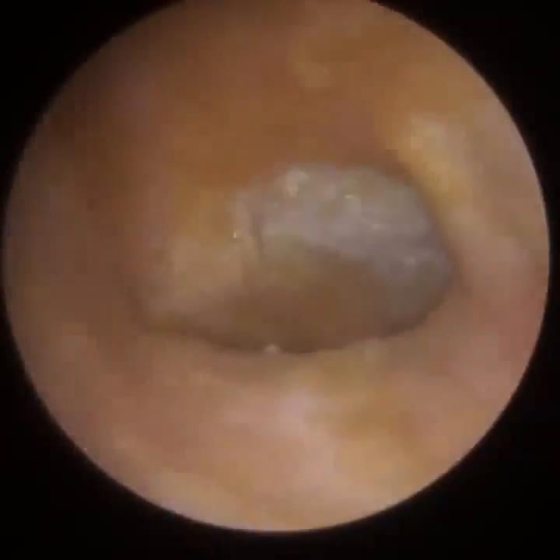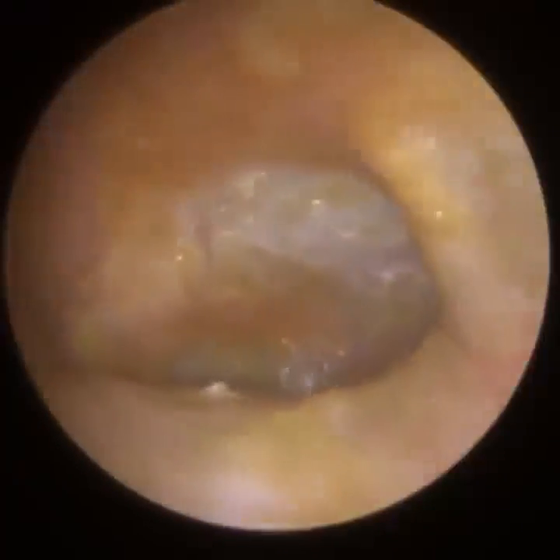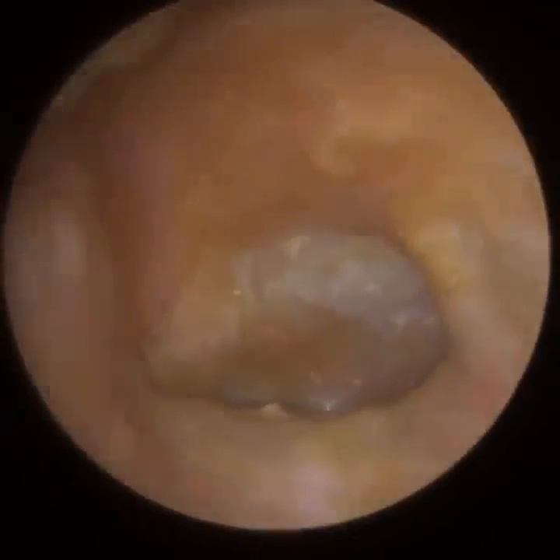Again, just using a fine end, just going in, just suctioning around. So the majority of the eardrum is now visible.